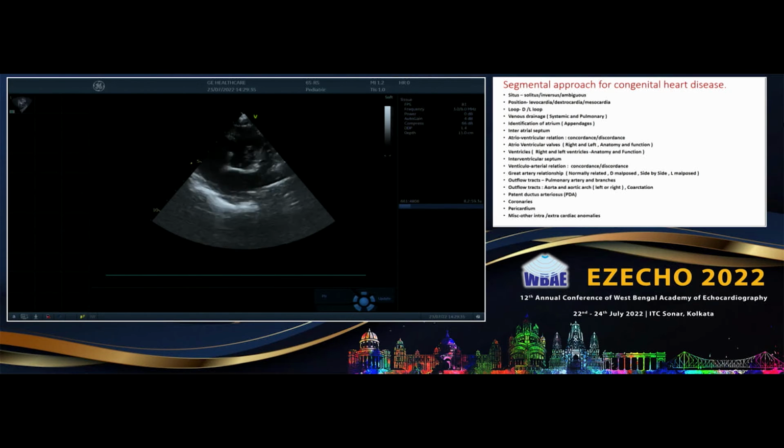Yes. From the short axis view, we are unable to see an outflow. She is showing something very nicely. You can appreciate in the short axis this big aorta, a large VSD, and there is no outflow. So this is a large subaortic conoventricular defect, right to left predominantly, and no outflow. So it is pulmonary atresia with large VSD, which comes under the tetralogy pulmonary atresia category.